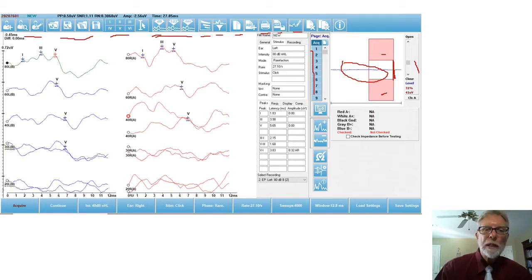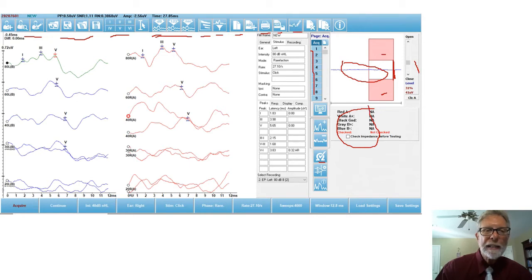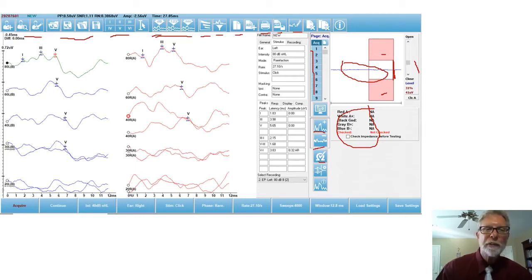When you click on this icon right there, you will get the impedance, and the impedance is displayed right over here. And if you would like to increase the size of the waveforms, there's an icon for that. Decrease the size, the scaling of the waveforms, there's an icon for that.